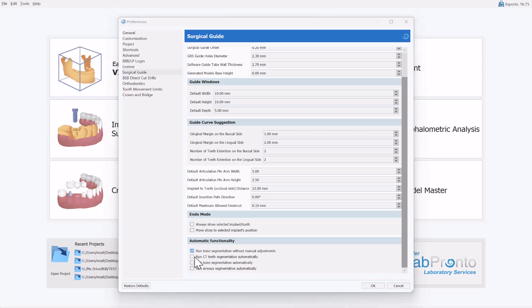The next three checkboxes are unchecked by default and are used to run jaw, teeth, and airway segmentation automatically every time you load a CT scan. If you would like the software to automatically run teeth, bone, and airway segmentation each time a CT scan is loaded, check these checkboxes and the functionality will run every time you load the CT scan.